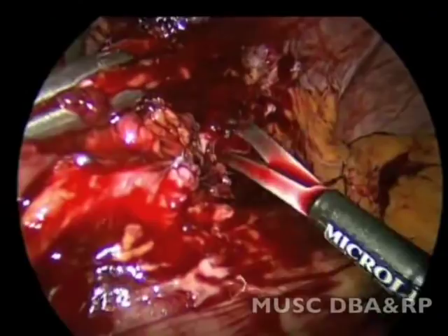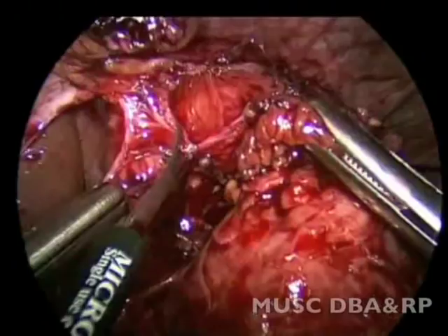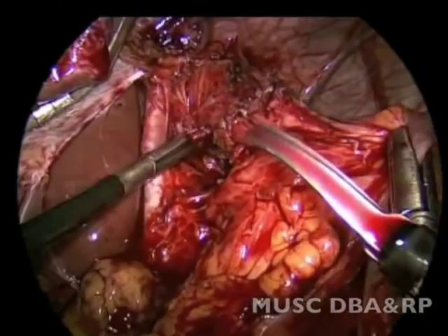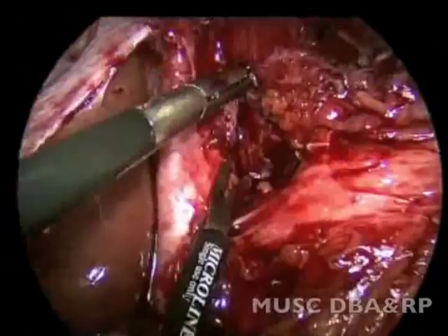Here, the decussation of the crura is identified. It is immediately apparent that the crural closure is extremely tight, and the posterior aspect of the intra-abdominal esophagus is taken down with sharp dissection.